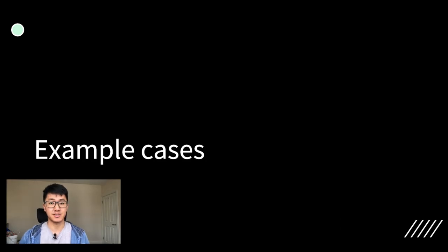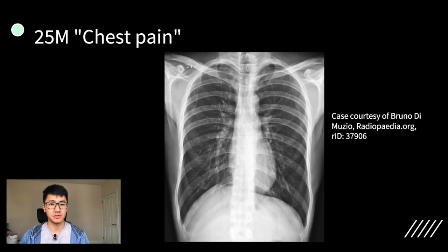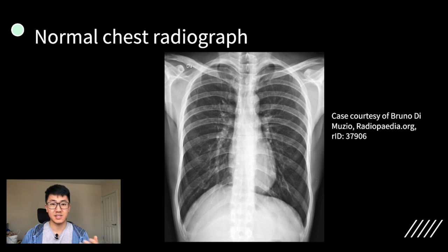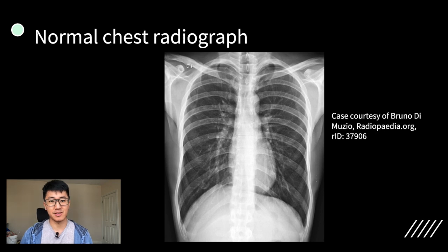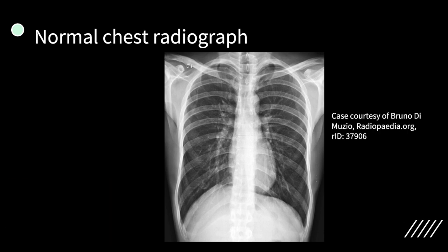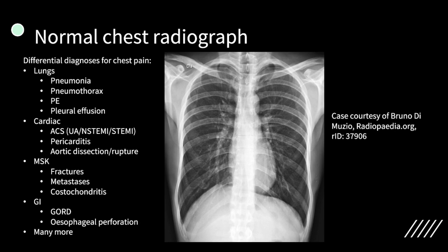Now let's go through some example cases. Firstly, we have a 25-year-old male with chest pain. Pause the video and try to work out what the diagnosis is. This is essentially a normal chest x-ray. It's really important to get familiar with what normal looks like before you start looking at pathology. The other important thing is that chest x-rays are often requested for chest pain, so it's really important to keep a broad differential diagnosis of all the various causes of chest pain, a few of which are up on the screen now.